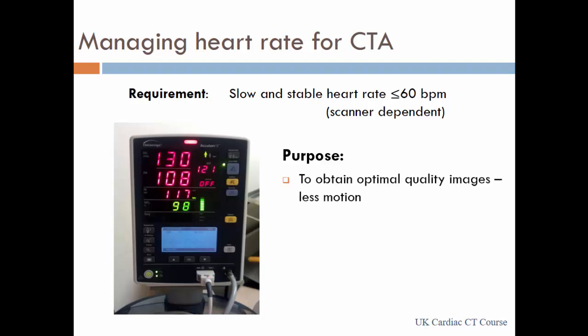The purpose of reducing the heart rate is to obtain good image quality with least motion, and second is to allow prospective ECG-gating, because you are lengthening the diastolic phase of the cardiac cycle, and hence lower radiation dose.